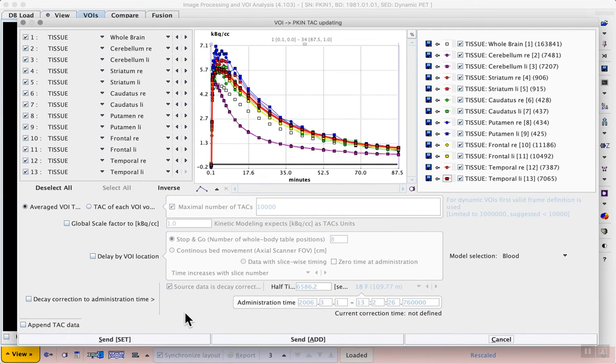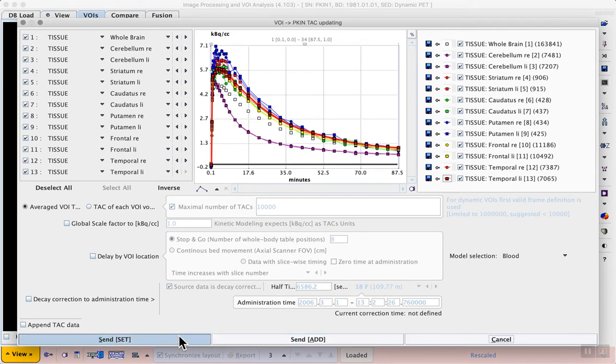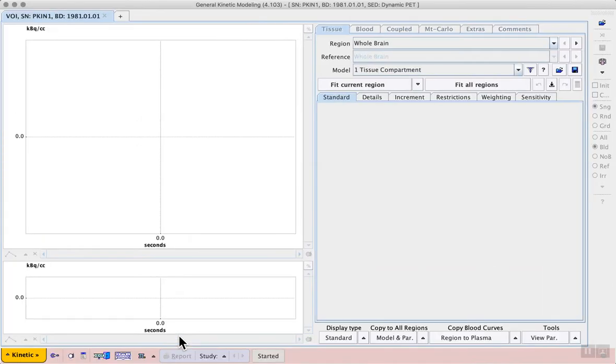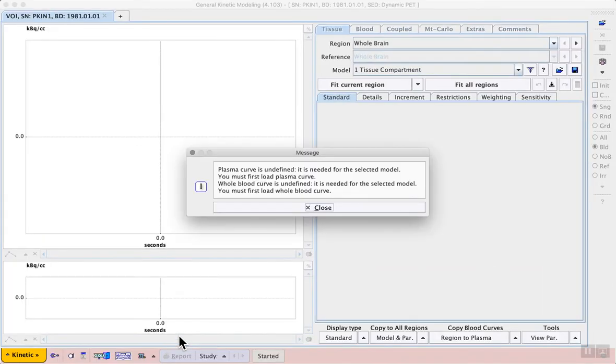Then I can send the time activity curves to the kinetic modeling tool using one of the send buttons in the lower left. First we get a warning about the missing blood data, so we should load that before proceeding.